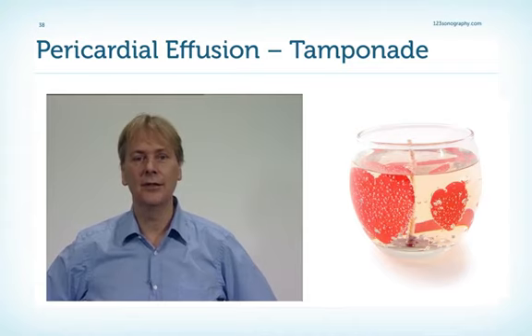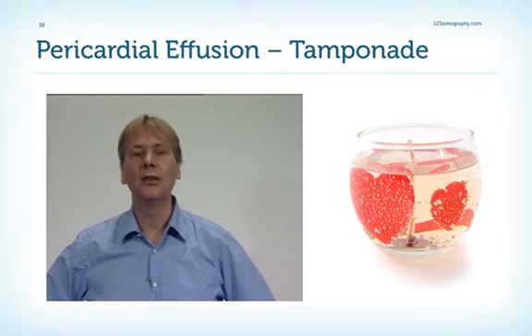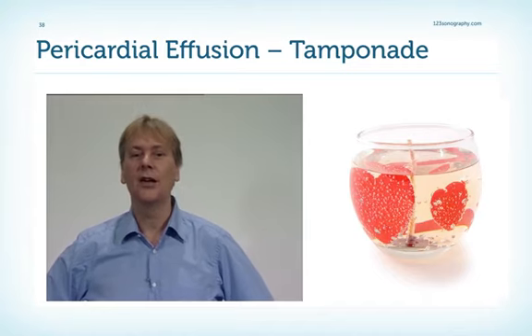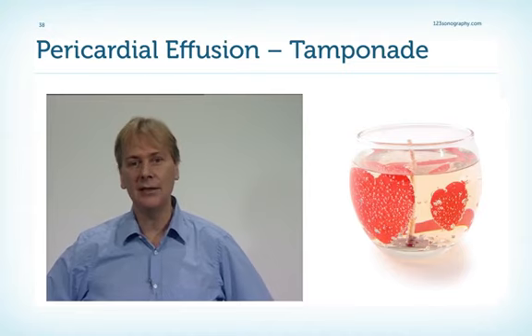To summarize this chapter, here's a short checklist for how you can go about it if a patient is referred to your lab with the question of tamponade and he has pericardial effusion. Well, the first thing that is very important: always look at the patient. If he has symptoms of cardiogenic shock, then you've already made the diagnosis. Then take a look at all the echo features we discussed in this chapter, especially the septal shift and also the fluctuations in the Doppler inflow signal across the mitral valve. Remember that many patients have subclinical forms of tamponade. These patients have to be followed up.